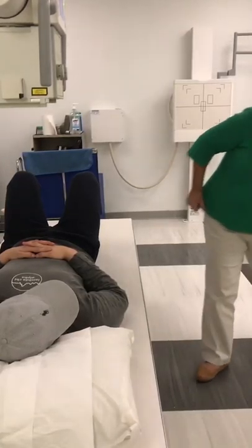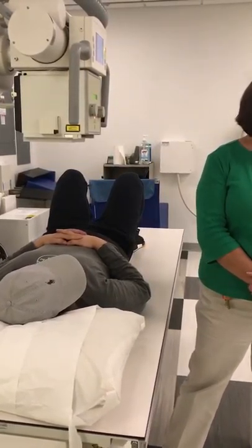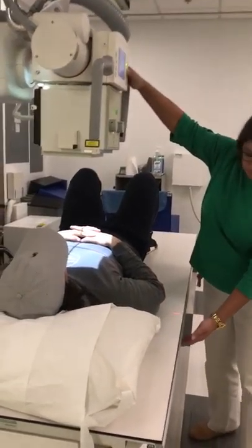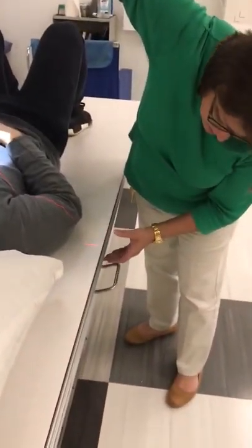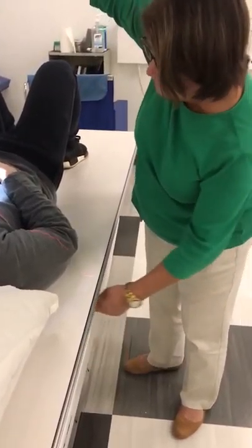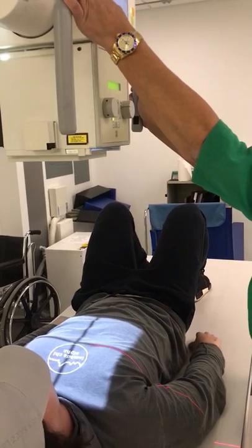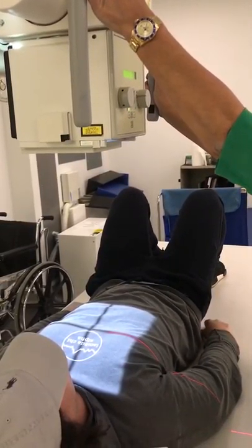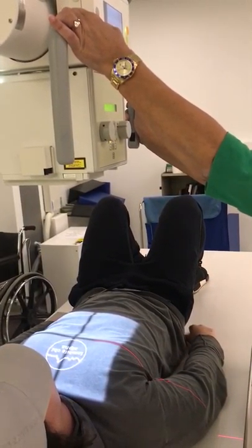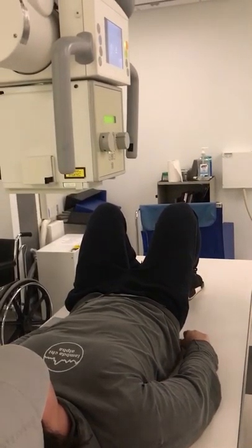Close my bucky tray all the way. I'll raise my tube. Table, comfortable height. Make sure that my tube and bucky are aligned. I'm going to set my SID. We know that we want our SID to be 40 inches. But with this equipment, we either have to have a 40.2 readout or a 39.8 because it won't register right at 40.